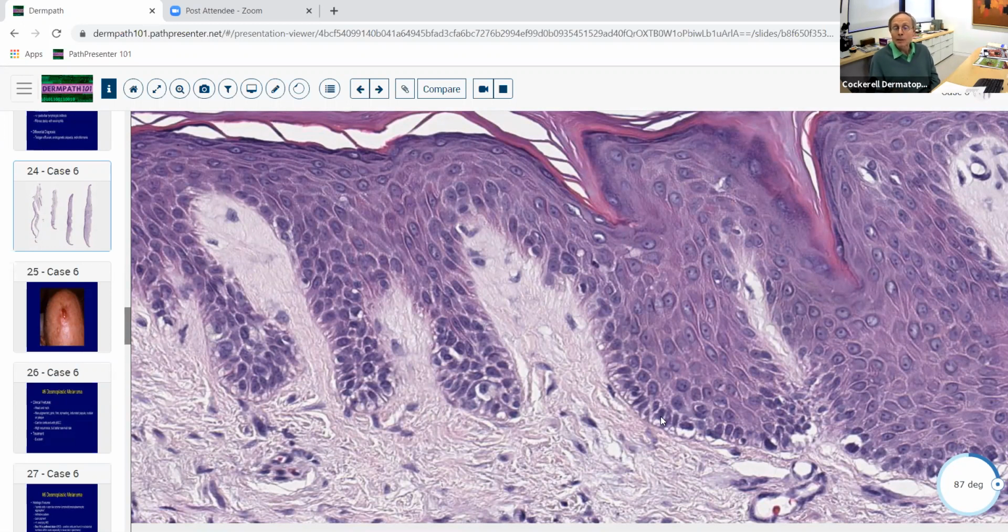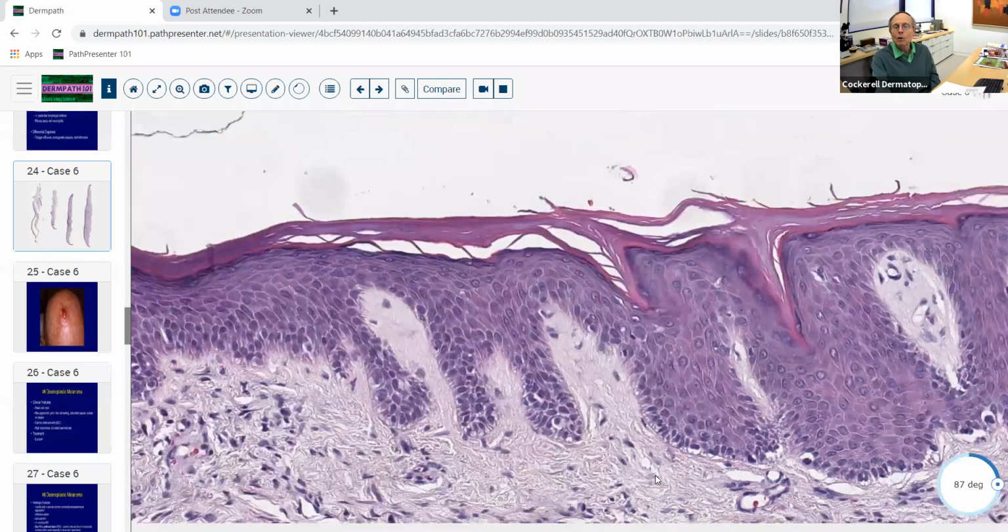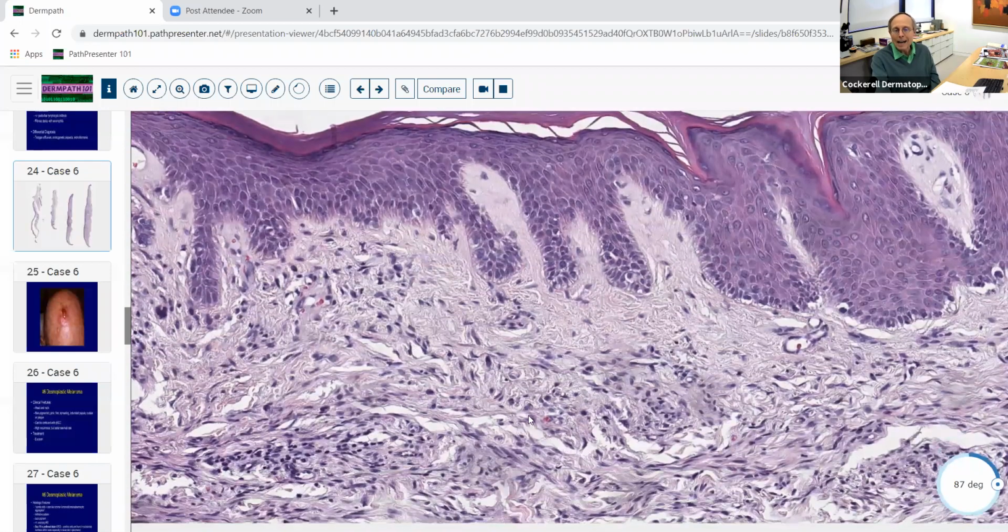And the reason we think about those is because those are relatively small papular lesions that are biopsied by a dermatologist. Usually an angiosarcoma, if it's spindle, is going to look like a large giant neoplasm that no one's going to confuse with possibly a skin cancer. They're going to think about that as more of a soft tissue vascular neoplasm, or a DFSP, a multinodular type lesion. So we think about those three most common ones most commonly.